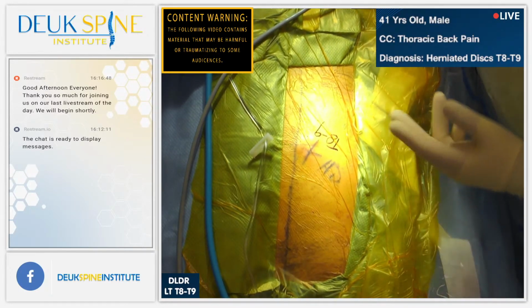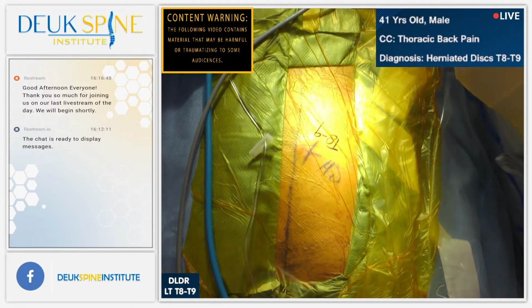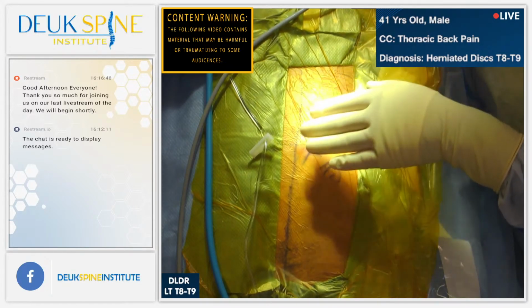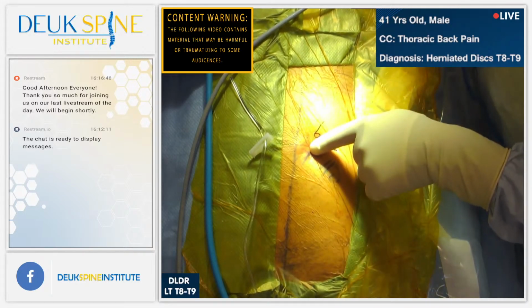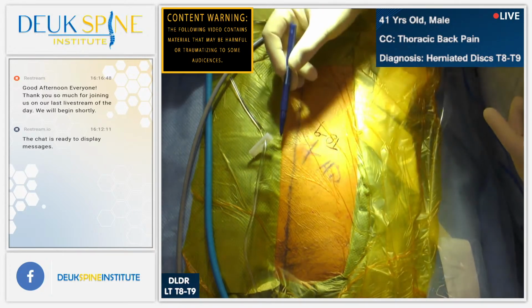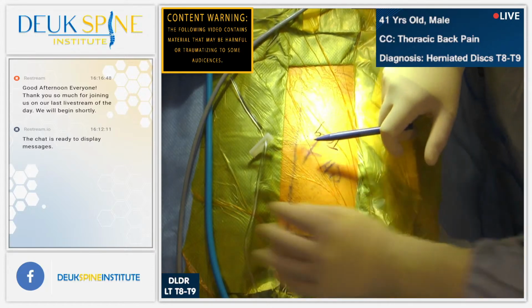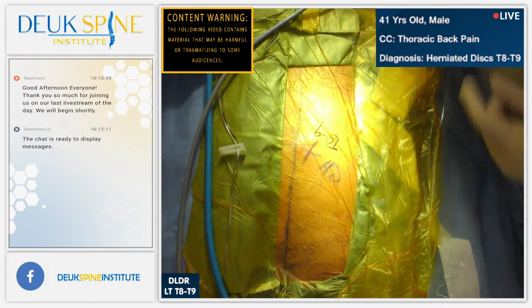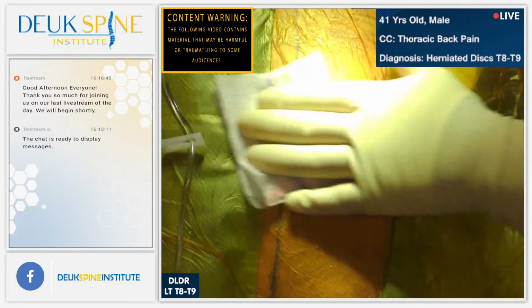He's here because he has a thoracic disc herniation at T8-9 that is causing back pain and narrowing of his spinal canal. He has additional herniations lower and I think one above, but his pain he pointed to was right here. And we just marked out where is T8-9 on the x-ray, and you see the line right here, Henry? This line right there? Yes, we do. It lines up pretty much perfectly with T8-9, which the report says is where his herniation is as well. His pain is more on the left side.